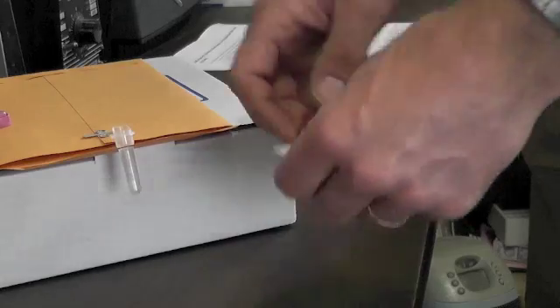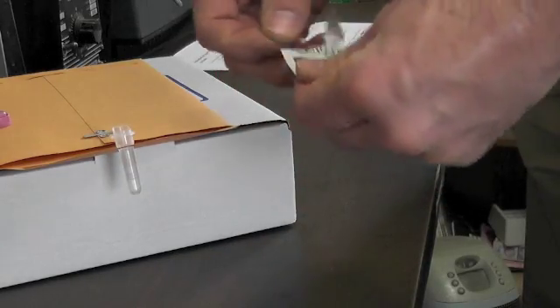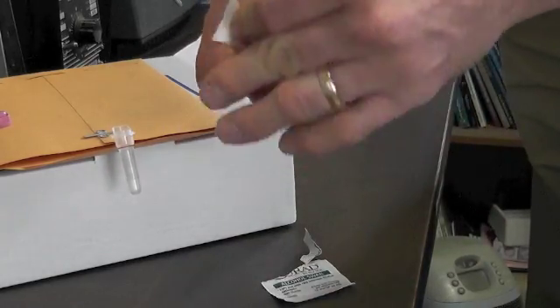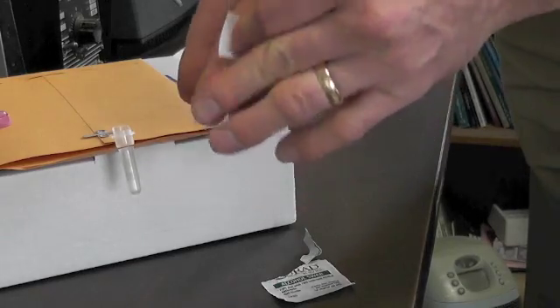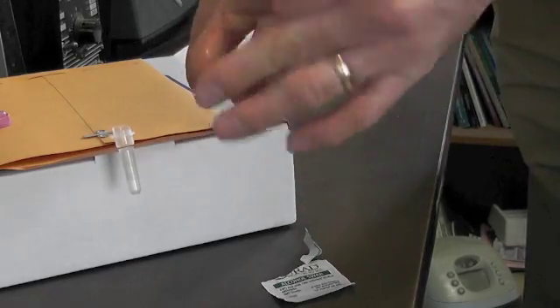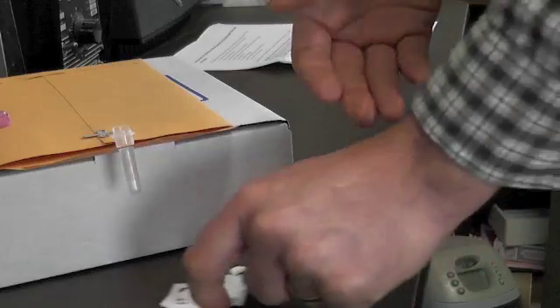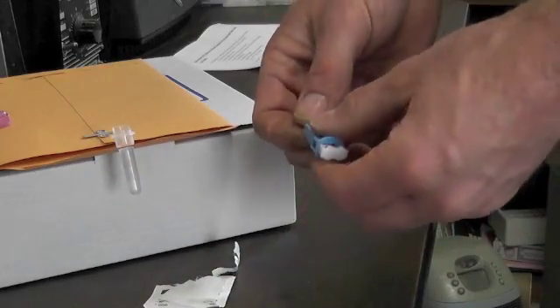Let's take the alcohol swab and wipe my finger off here a little bit. I'm going to use the middle finger here this time. Wipe that side there, let it dry a little bit. And after I prick my finger, I'm going to wipe it off again with that alcohol swab.